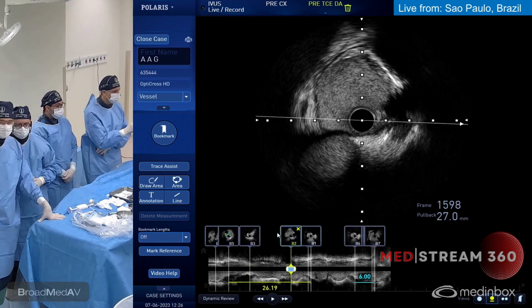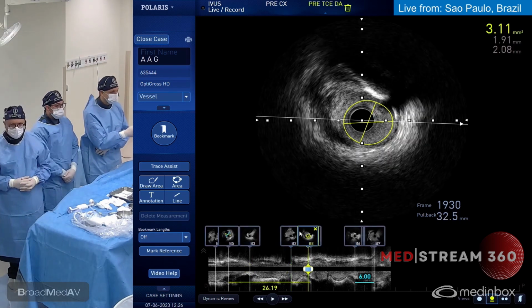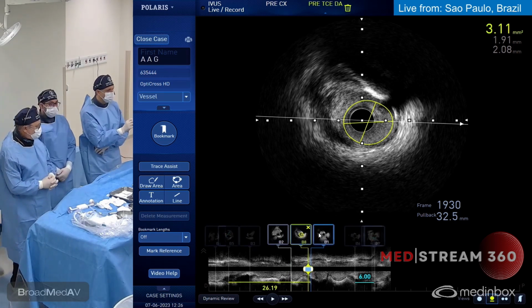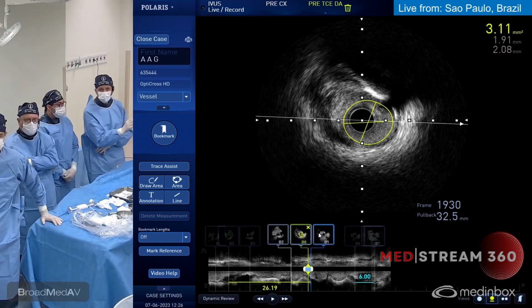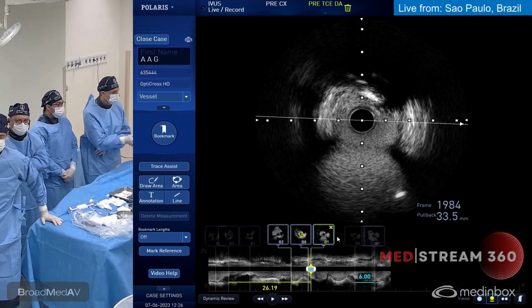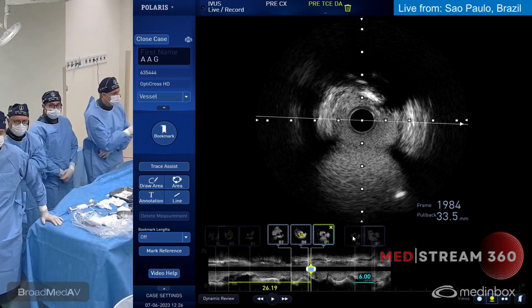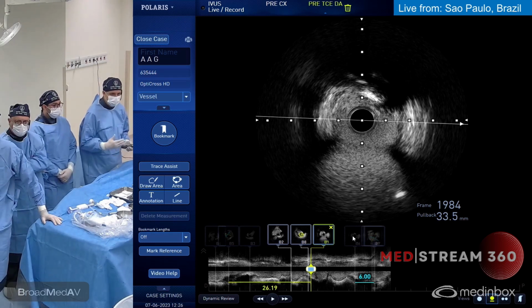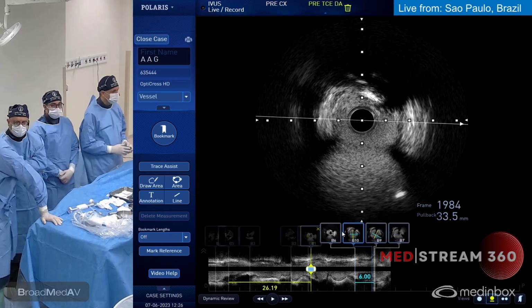It's calcified here. Next. Here you can see the proximal diagonal. Next. Here, the ostial location is about 3.1 millimeters square. So this is the minimum lumen area at the very ostium of the LAD. Next. Here you can see how the plaque extends into the left main. So we see the plaque does not end at the ostium of the LAD. It ends at the left main, which is very common. Most of the cases are like that.